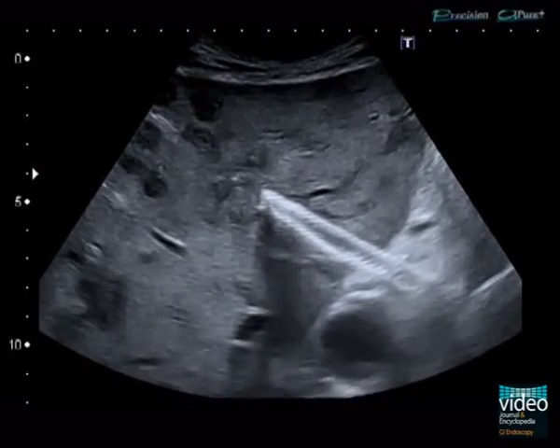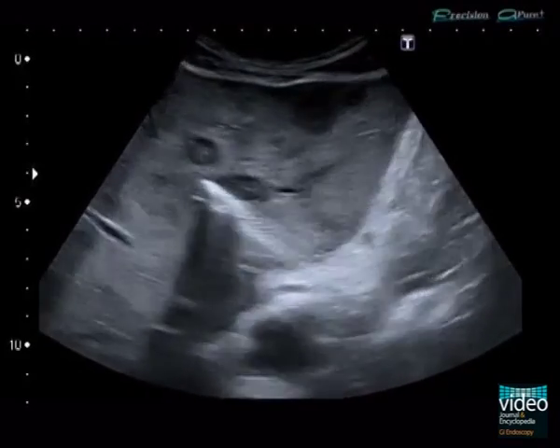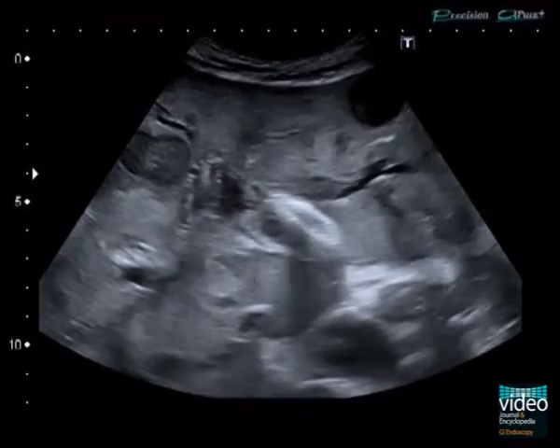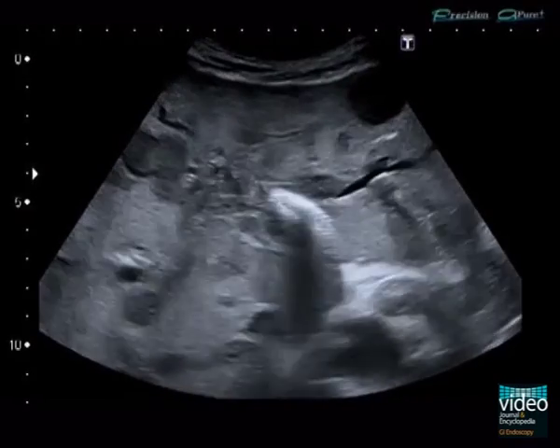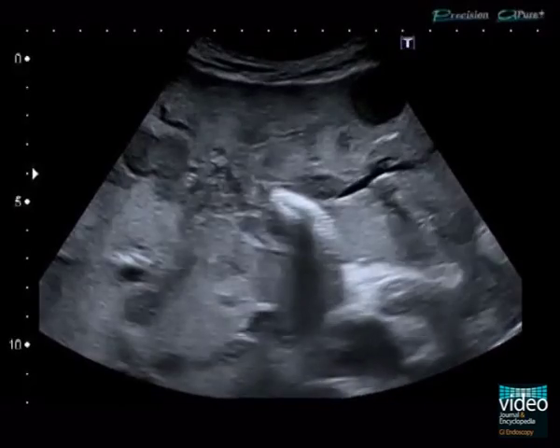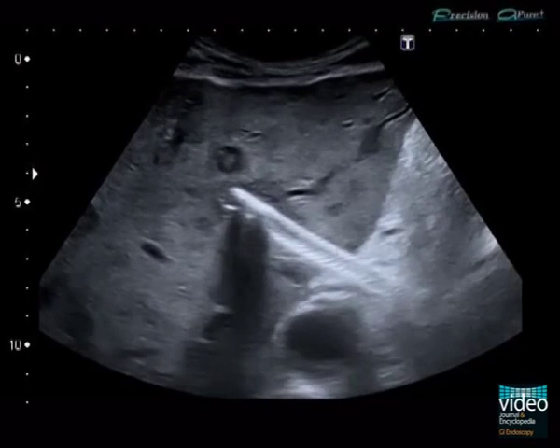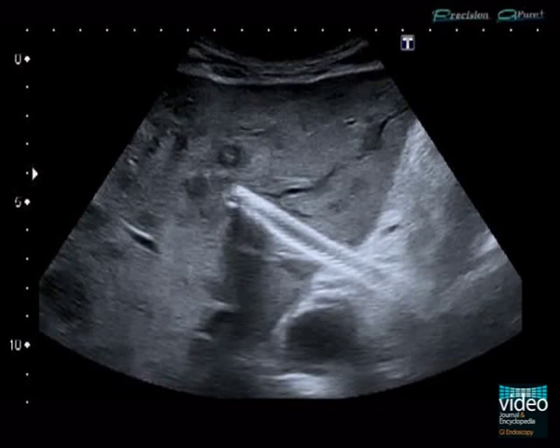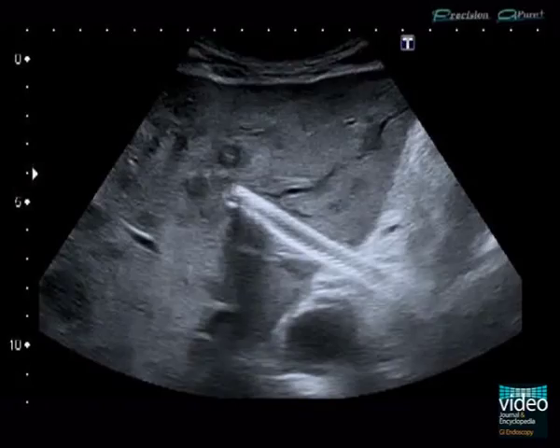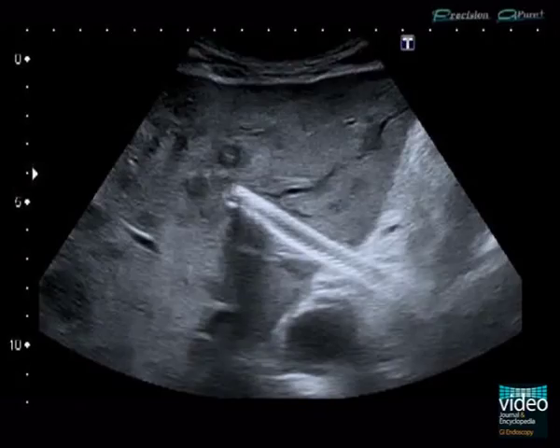On the first post-interventional day, stent position is controlled using trans-abdominal ultrasound. The intrahepatic bile ducts show normal calibre with aerobilia. The stent itself crossing segment 2 and stent opening are complete. The intervention was performed with peri-interventional prophylaxis using the antibiotic ceftriaxone. Worth mentioning is that re-intervention via the stent is possible but infrequently necessary, since in patients with malignant jaundice there is a poor prognosis with limited life expectancy.